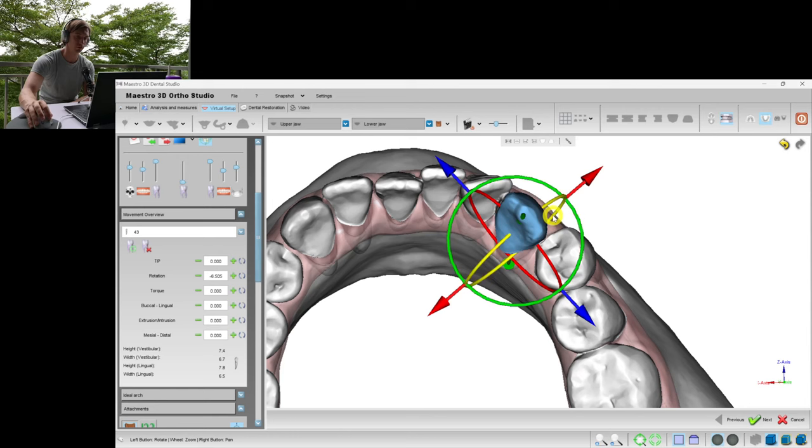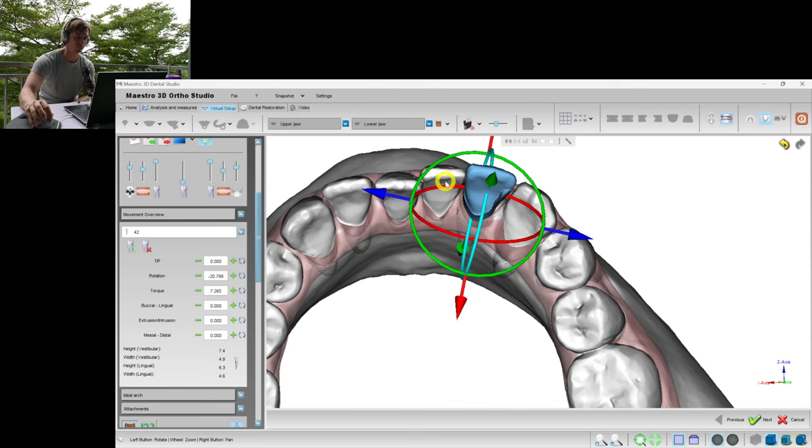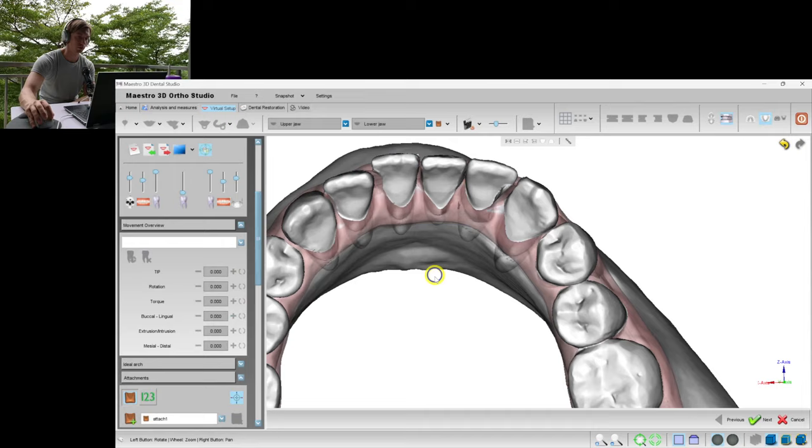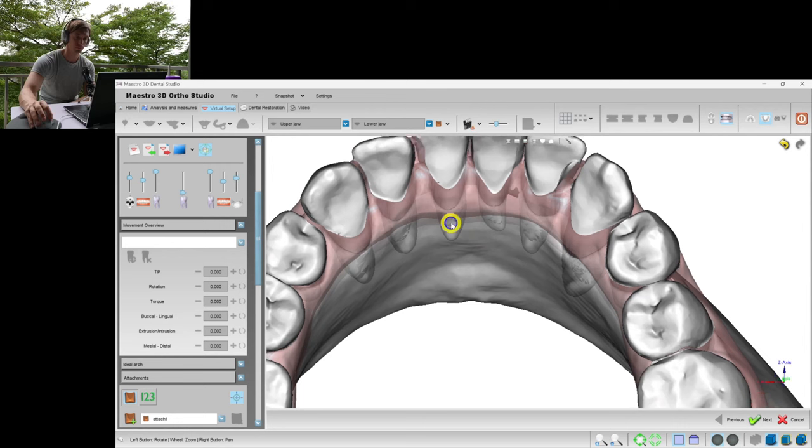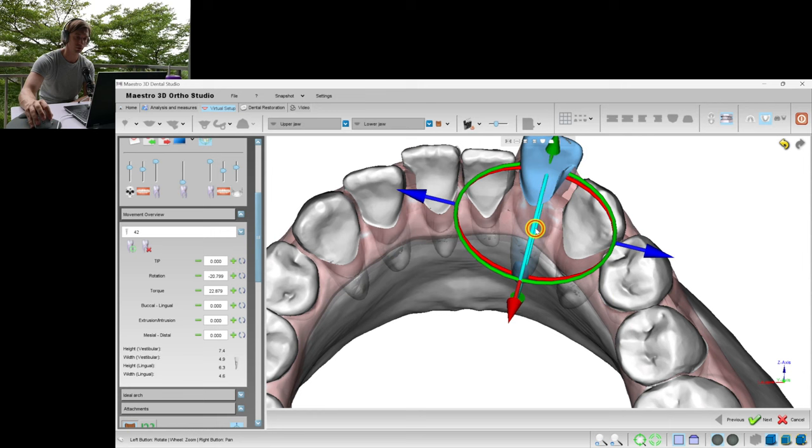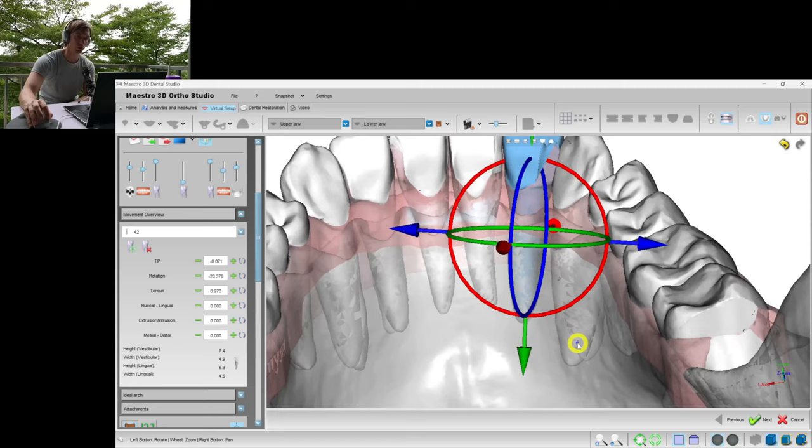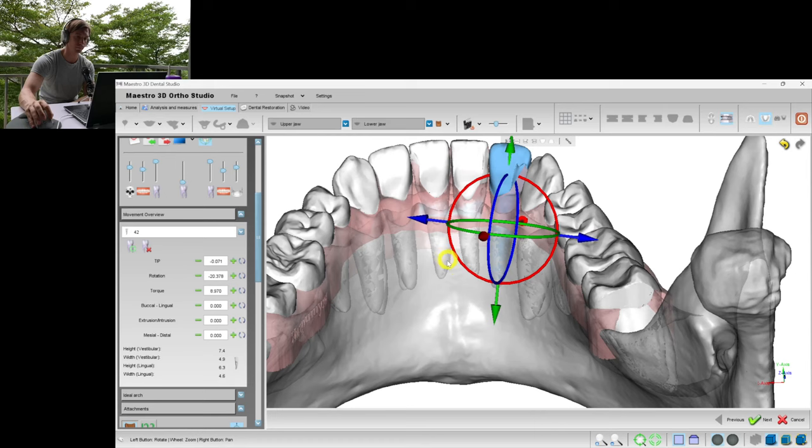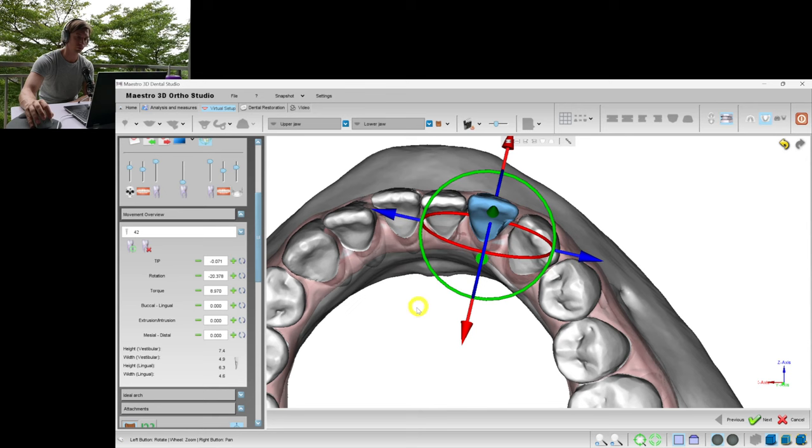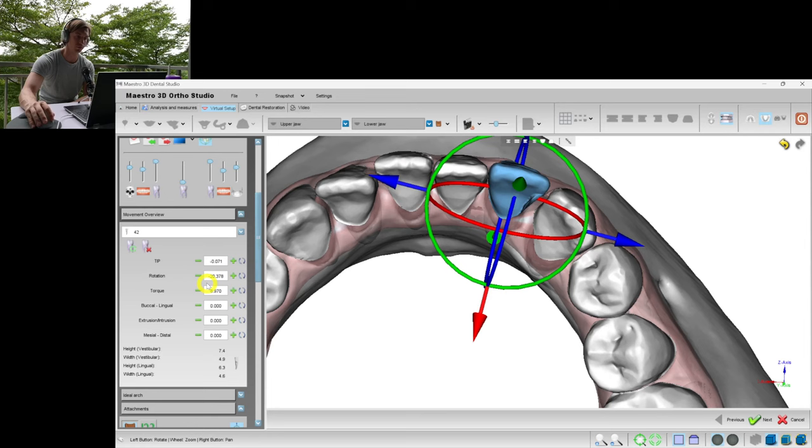Now we are expanding the incisors. Here we should keep the roots inside the bone, so don't exceed this. Don't put the roots outside of the bone. We set the center of rotation in the middle of the root. For this case I would not exceed the ratio between rotation and torque, so that the rotation should always not be higher than the torque degree.